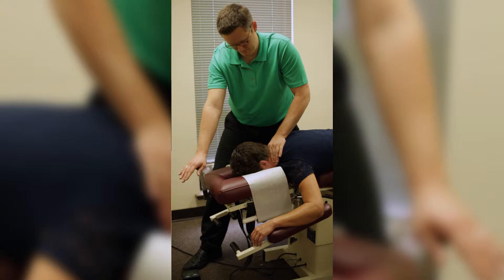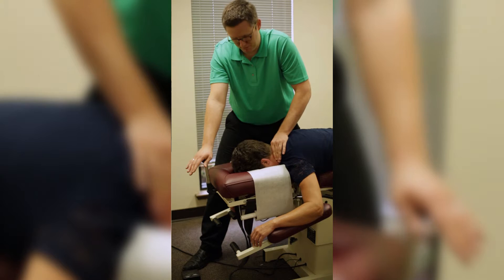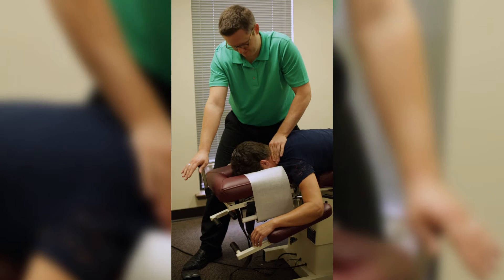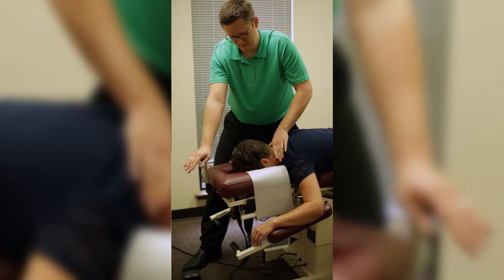This technique is very effective at helping people from things as simple as regular neck aches to things more complicated like post-surgical continued pain or disc herniations. There's no popping or twisting with this technique, and it's very effective.